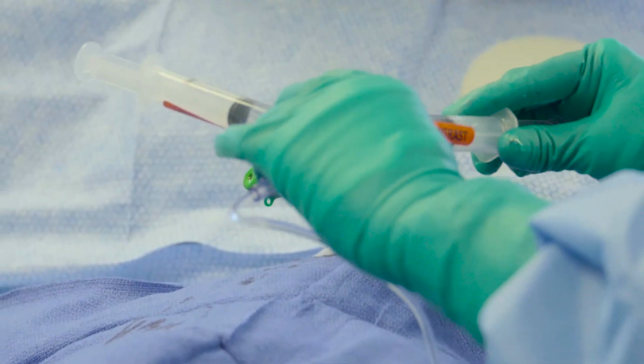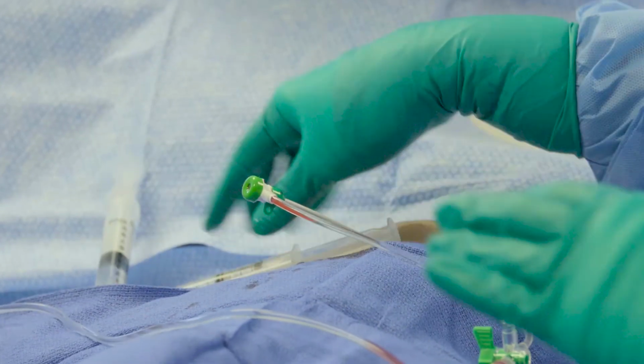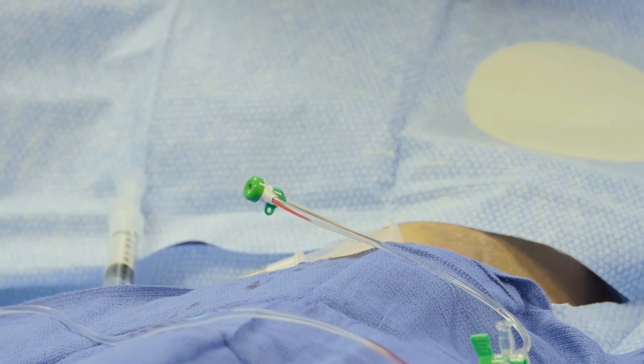If you have been diagnosed with cancer, your oncologist may consider starting you on chemotherapy. Chemotherapy oftentimes has to be given intravenously, IV, and your blood will be drawn for labs quite frequently. To help deal with these issues, it will be best to place a Mediport in your chest.